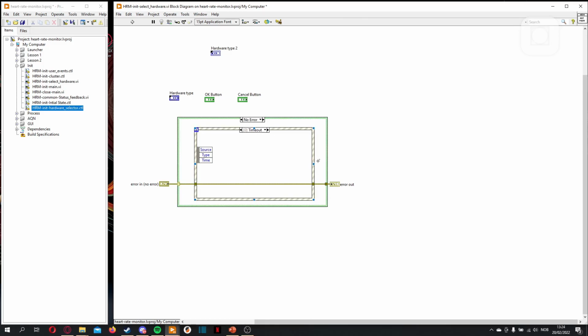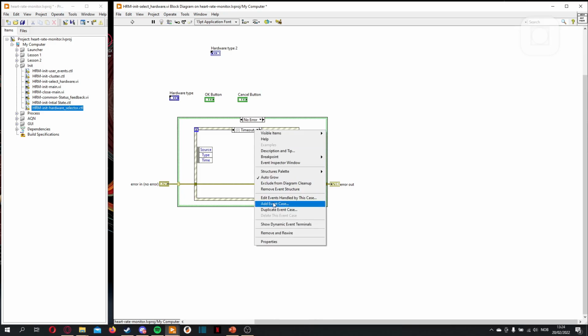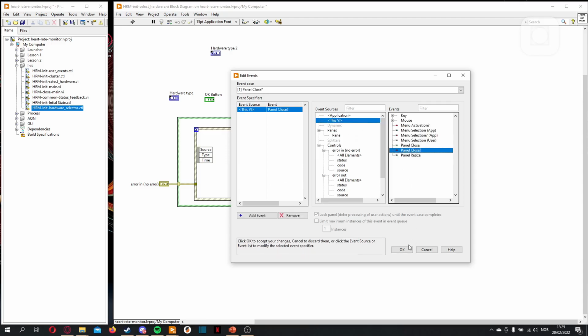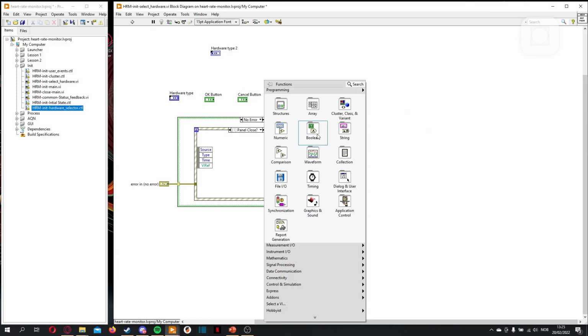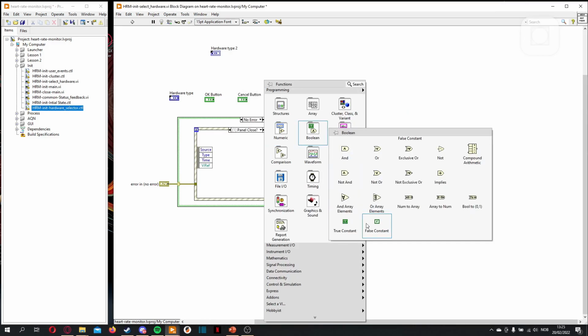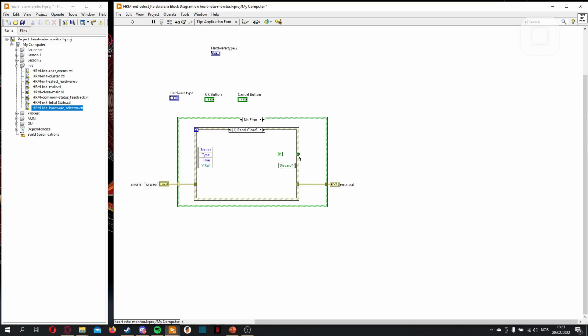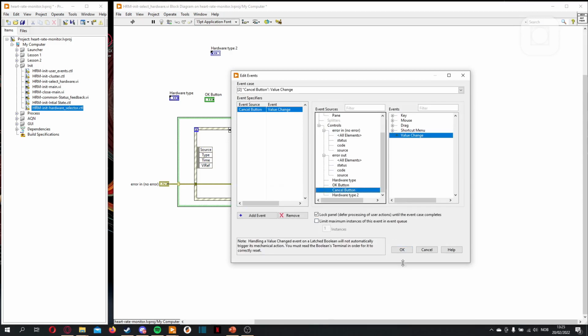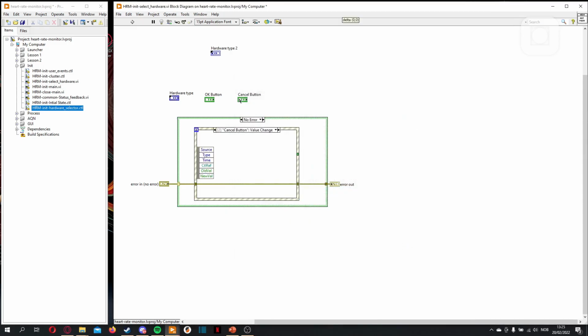So what can the user do? It can either cancel, press the X button here, cancel, or press OK. So we'll start with the easy ones, which is if they want to just close it, it would mean the same as canceling it. So we'll make a case for that. I want to have a selection: if it's cancelled, then it's false, and then it just chooses simulated mode. I also want this to be default if unwired, so we don't have to make it for every case. Next case is the cancel button. So if they press the cancel button, we also have a sending out a false signal.